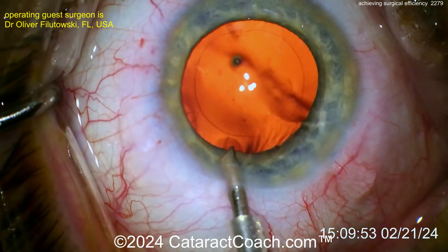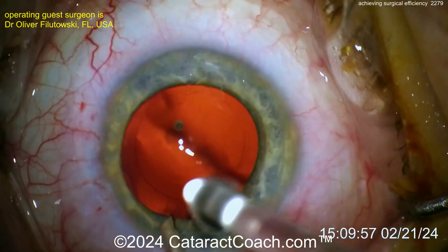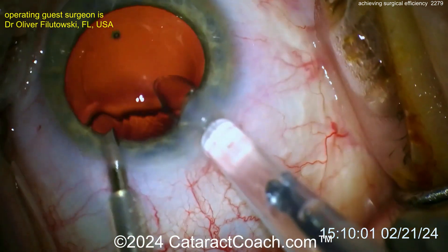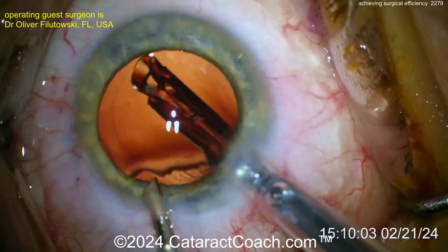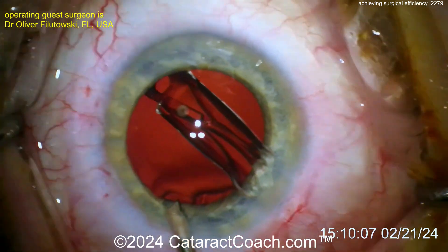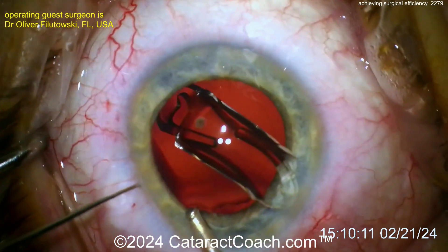Look at that — that looks fantastic. The capsule bag looks pretty clean, that looks really quite good. Now let's see the implantation — the eye is well hydrated. Going inside there — the lens goes right into the capsule bag. The bag is being inflated by that AC maintainer. Now get this thing dialed in and you're basically done with the case.